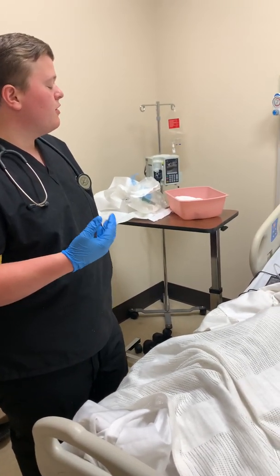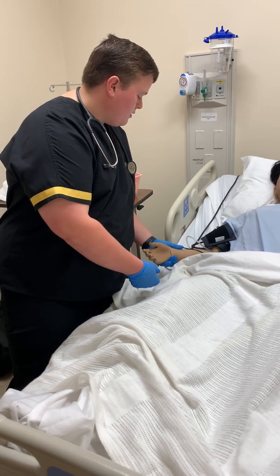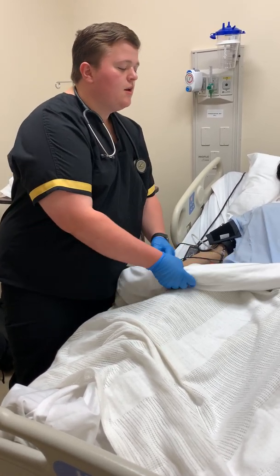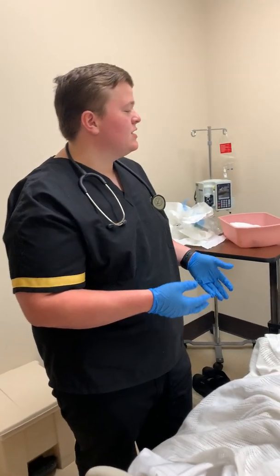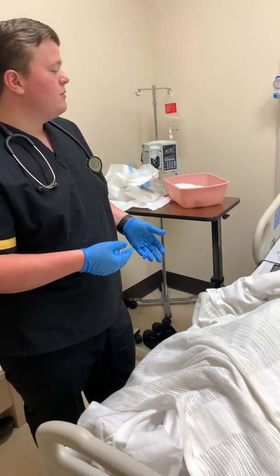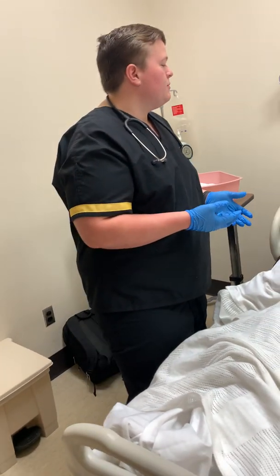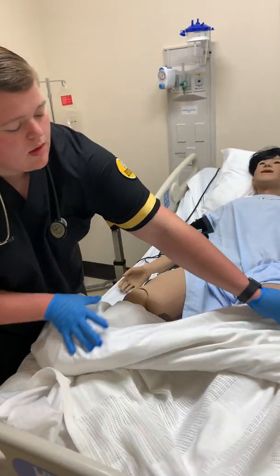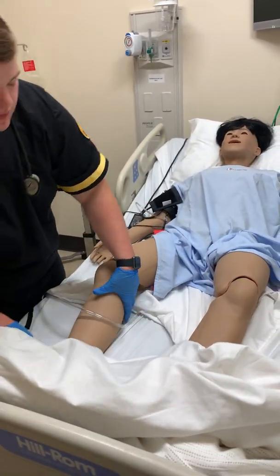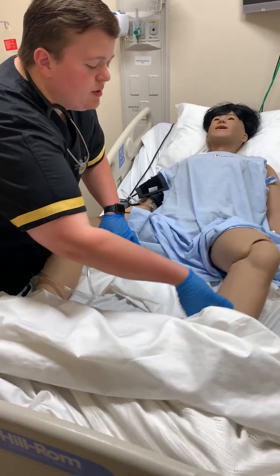Ms. Smith, could you confirm your name and your date of birth? Everything checks out here. So Ms. Smith, what we're going to go ahead and do is discontinue the catheter. It's going to be similar to what we did the other day. We're going to have to get you in the same position. So we will return Ms. Smith to the dorsal recumbent position.